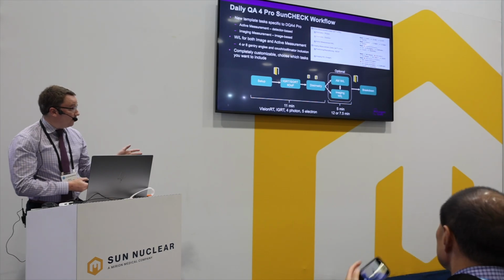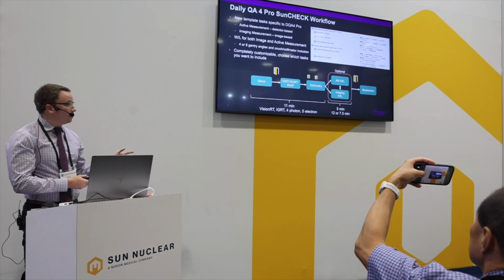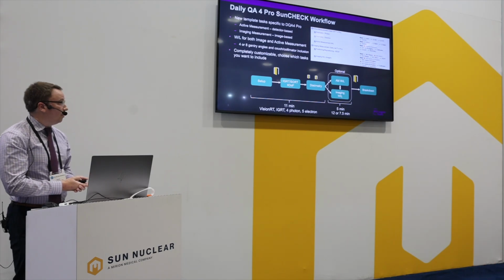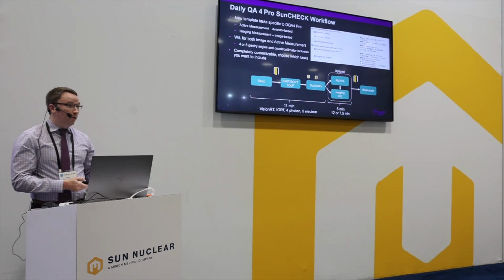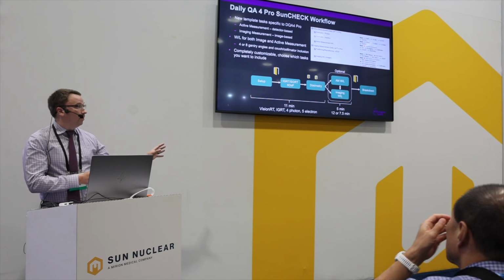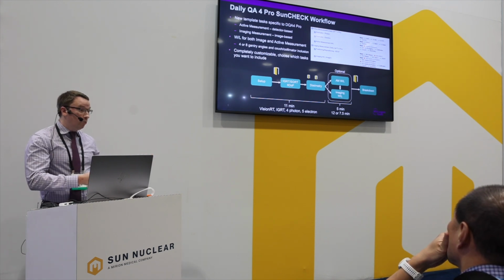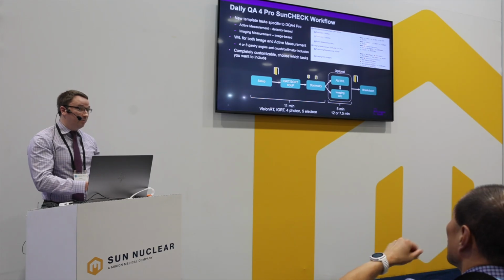So those Winston-Lutz measurements with this device, they cut our time basically in half for each of them. We really save about 15 minutes compared to the multi-met Winston-Lutz cube. And it's very important to note that when you're doing this workflow, it's with the 6DOF base plate, and you're doing all of these Winston-Lutz tests with applied pitch and roll, which we don't typically do.